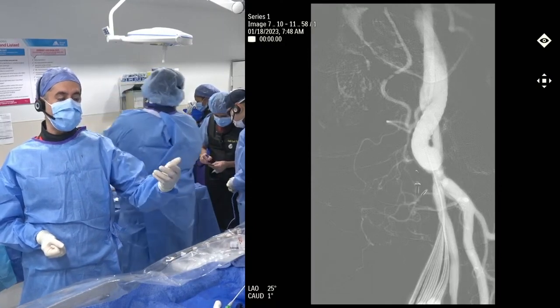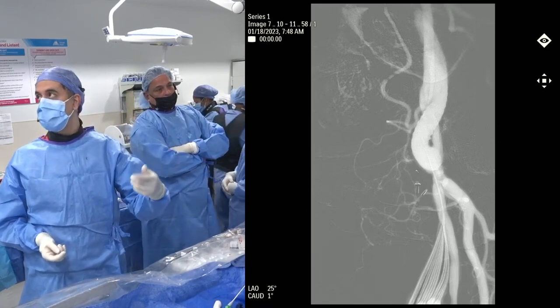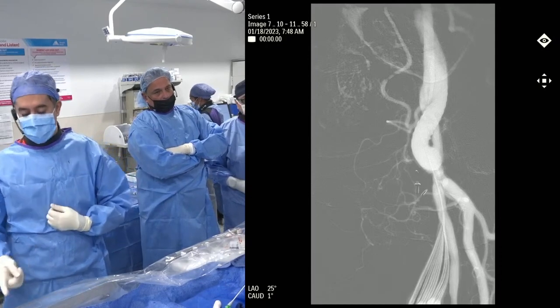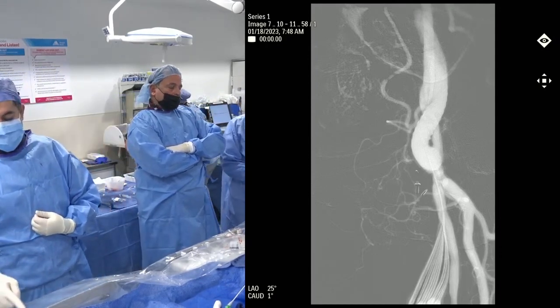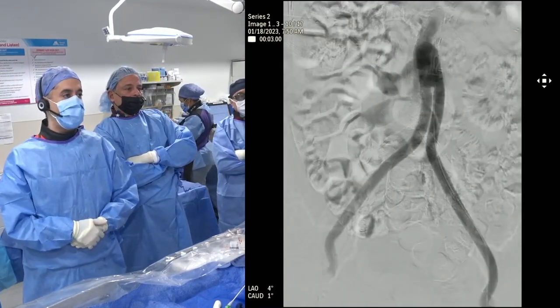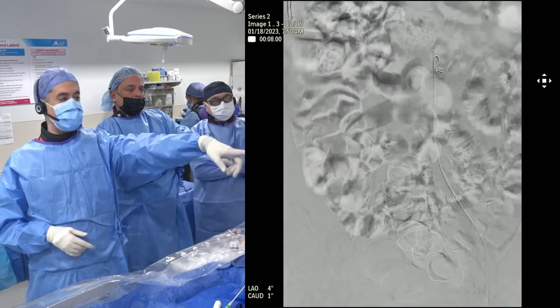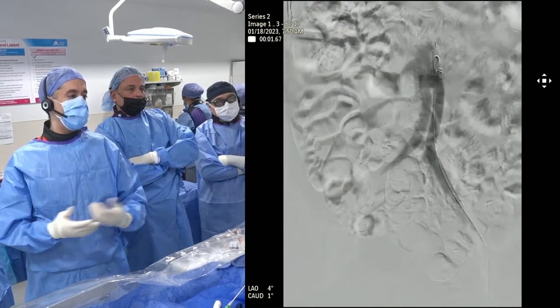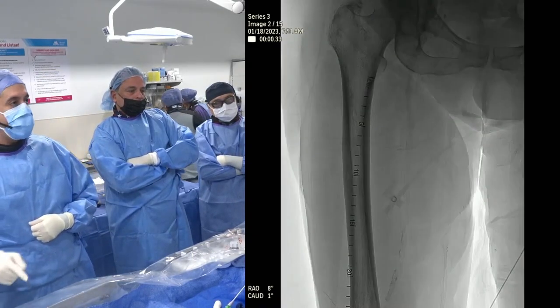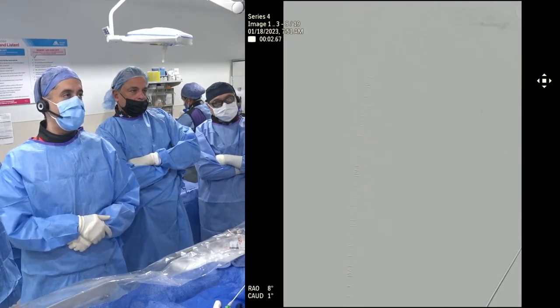We got an ultrasound-guided access in the most proximal end of the SFA as much as we could. We did a roadmap just to confirm so we could wire into the bypass graft, which was our goal. And here you can see we did end up in the bypass graft. Then, like Usman showed in the pictures, you can see the aortoiliac bypass all the way down. The bypass graft itself looks good, but just after the anastomosis you see that very tight, almost total, subtotal lesion with a lot of calcifications, which you can see on a non-DSA picture. And then we, of course, wanted to do a runoff to define the anatomy well.